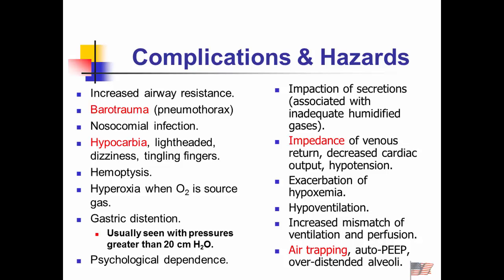Okay. If I substitute positive pressure, I take away that. Don't have blood coming back, don't have preload, don't have cardiac output. So I can cause a drop in blood pressure simply by using positive pressure. So one of the first things we're going to do after we place a patient on a mechanical ventilator or a non-invasive ventilator is monitor their blood pressure. Like I said, we don't see that effect as profoundly with IPPB, but it is a potential that is there.